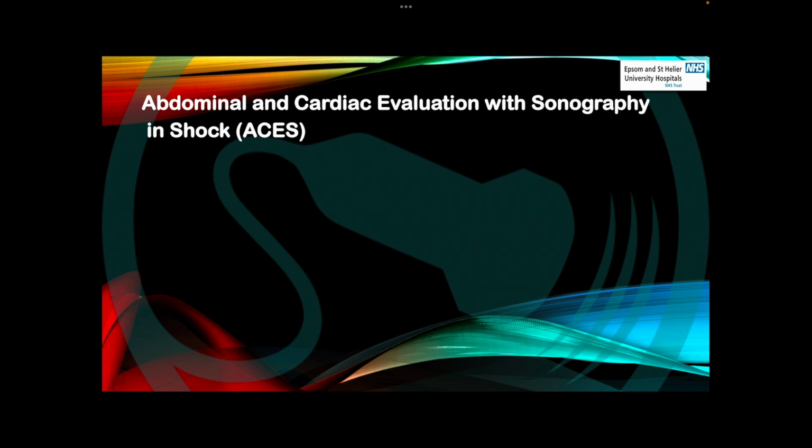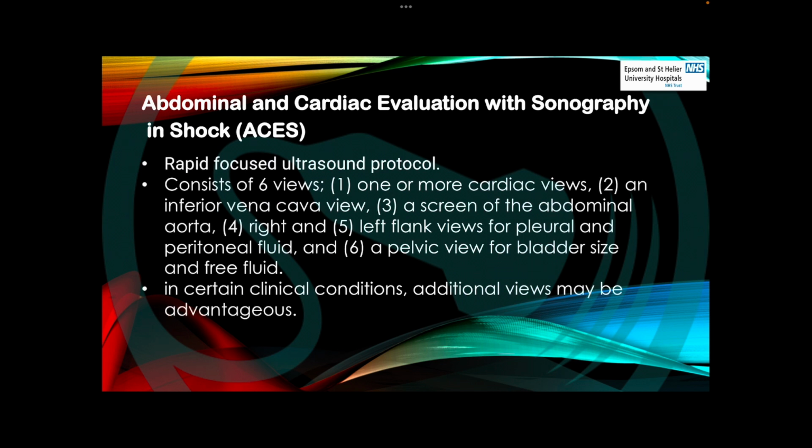This protocol has been mentioned by the Royal College of Emergency Medicine as well. It provides a rapid focused ultrasound protocol consisting of 6 views for use in undifferentiated shock. Many emergency physicians are already familiar with the views from the FAST, which is the Focused Assessment with Sonography in Trauma protocol, and also from the emergency department ultrasound assessment of the abdominal aorta.